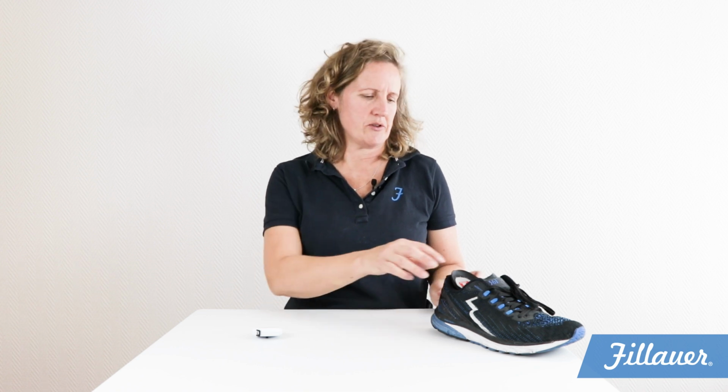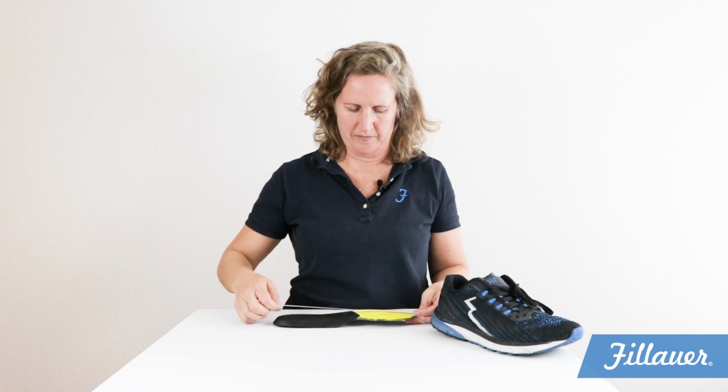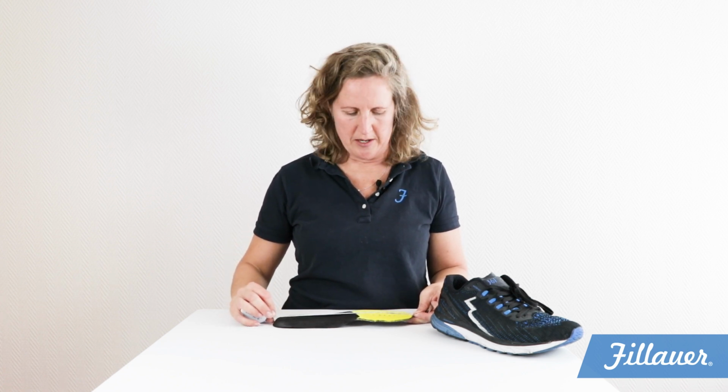The C measurement on the form is the desired length of the foot plate. This is not necessarily the length of the patient's foot, but rather the inner length of the shoe. To determine this, the best way is to use the insole in the shoe. You take it out and you measure the length of it. For this shoe, the length is 270 millimeters. Mark the order form with 270 millimeters.